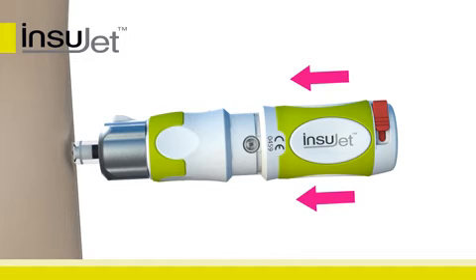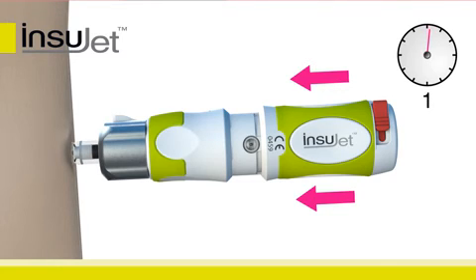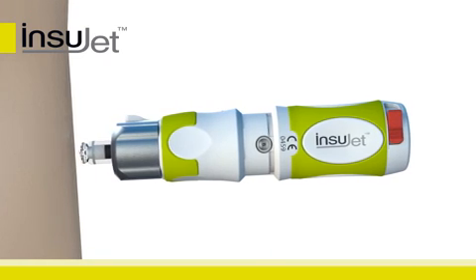The Insujet has administered the dose. Continue to hold the Insujet firmly against the skin for at least five seconds without moving. This is important to prevent leakage of insulin from the injection site. Now carefully remove the Insujet from the skin.